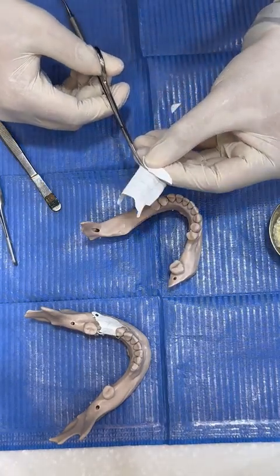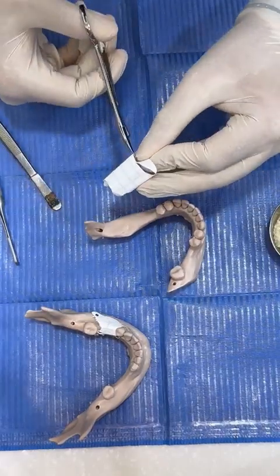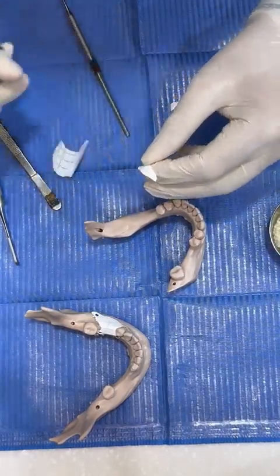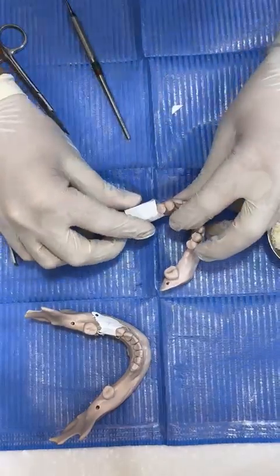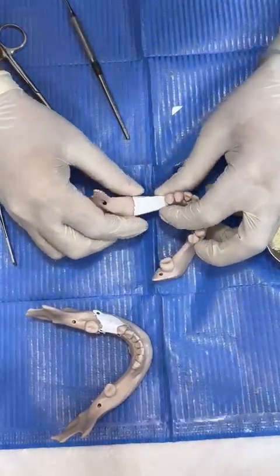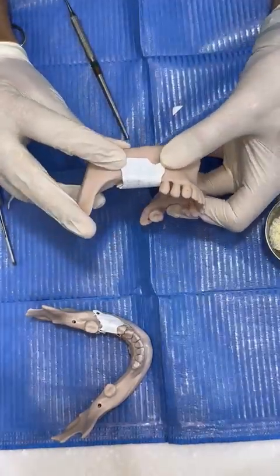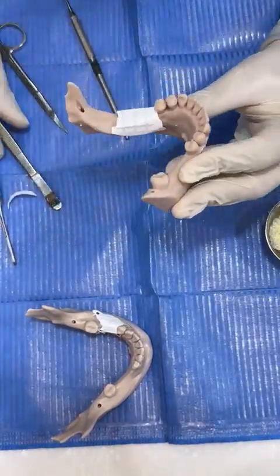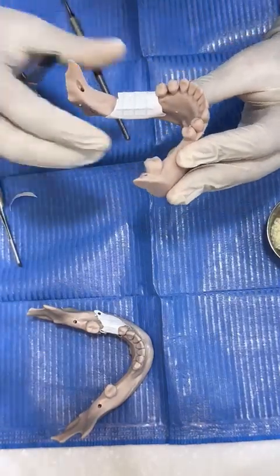Then I will trim them later. Okay, now it's okay. I can see my membrane. If you see here, this is exactly where I want the future shape of the ridge to be.